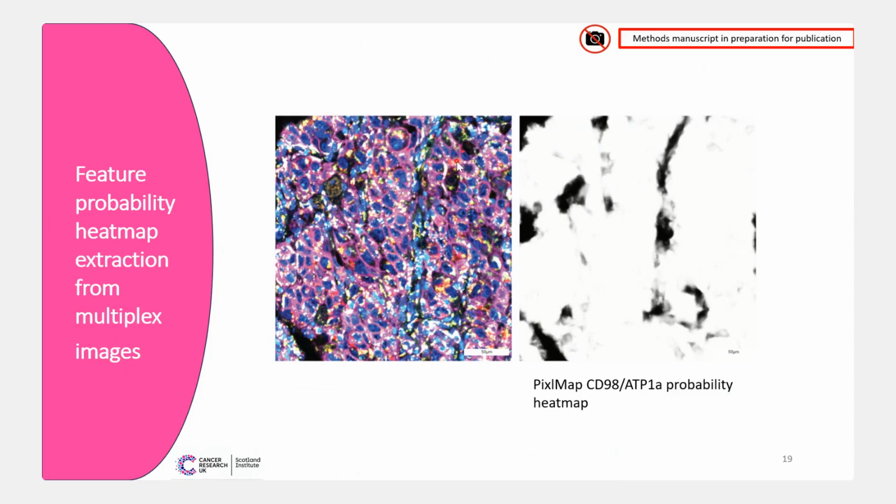By just inputting that channel within the AI architecture, and viewing the positive feature, you can see that it's got the area of positivity really, really accurate, despite not being given a cocktail marker within the training. It's just learned that this region of positivity looks the same as what was given in the training set, so it thinks that it's positive for that corresponding marker.